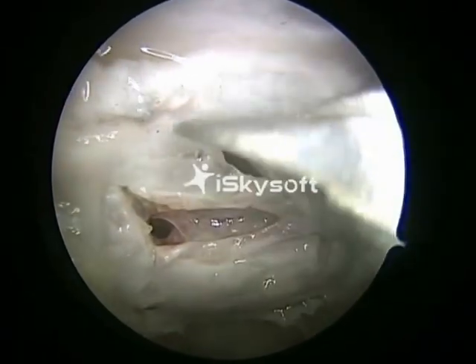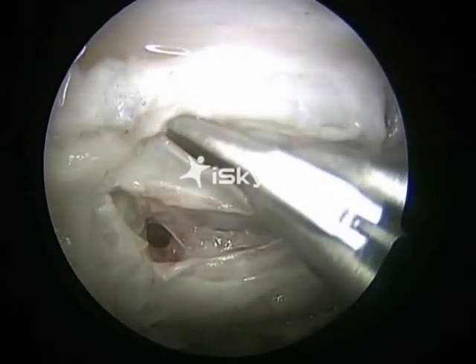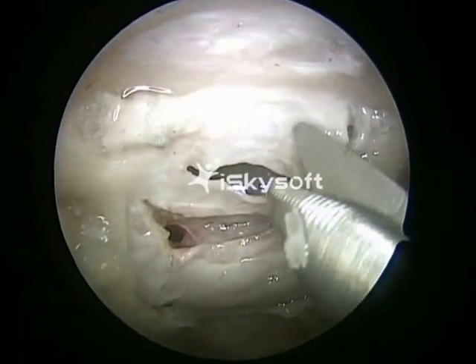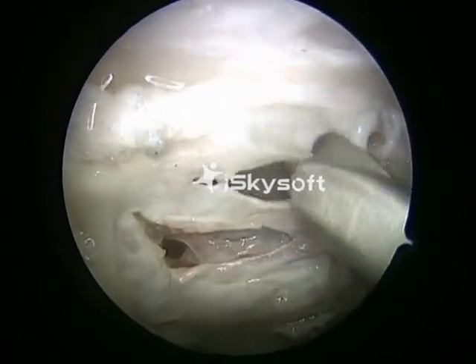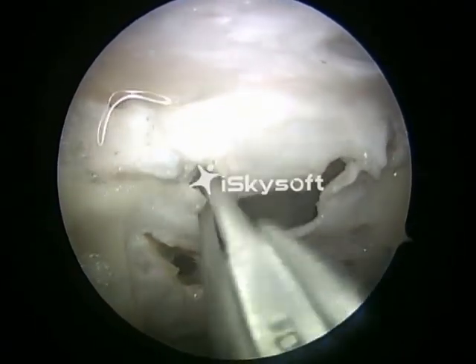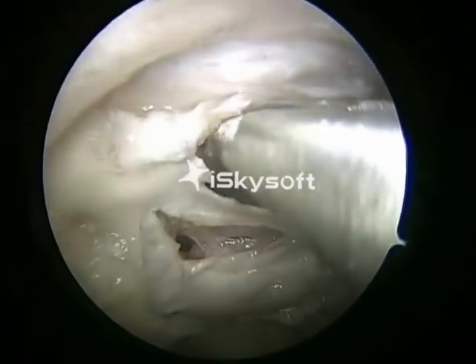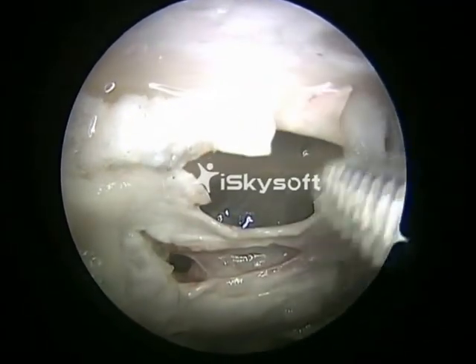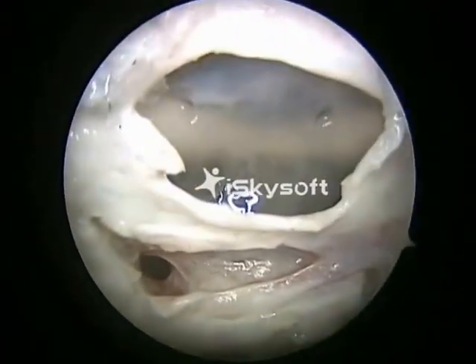Now we have opened the dura just superior to the superior intercavernous sinus in the region of the tuberculum sellae. We make a U flap, a superiorly based U flap, and once we do that, we reflect the flap superiorly and we see a layer of arachnoid inside.